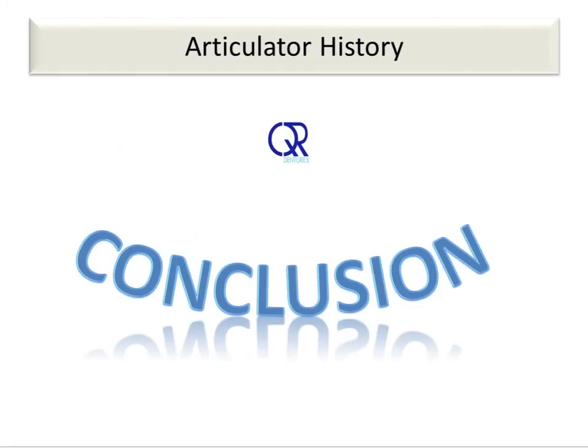This was a brief but comprehensive insight into our articulator and occlusal history, and it goes some way in explaining why the denture patient, especially the edentulous denture patient, struggles to function effectively with the dentures we provide. History tells us that Frank's opinions did not gain traction in the world of dentistry, and the theories of Monson and the geometric school continue to dominate the designs of articulators to this day.